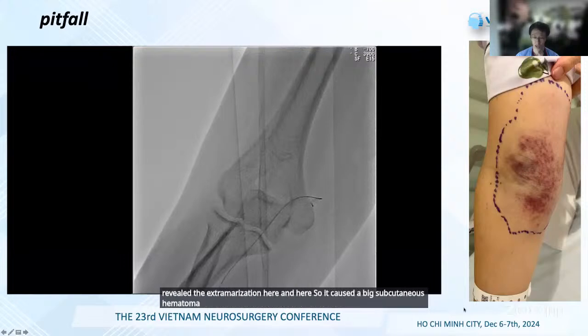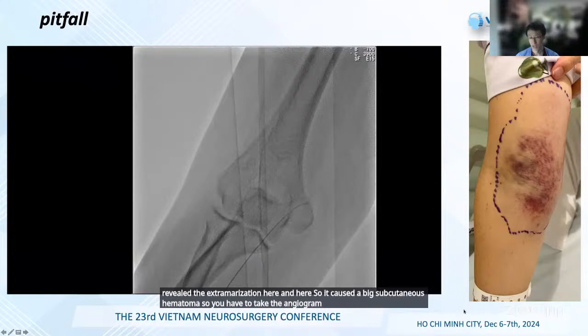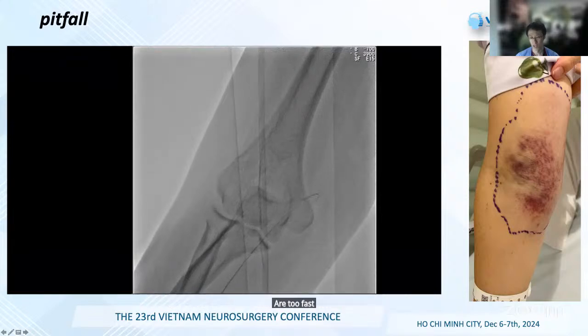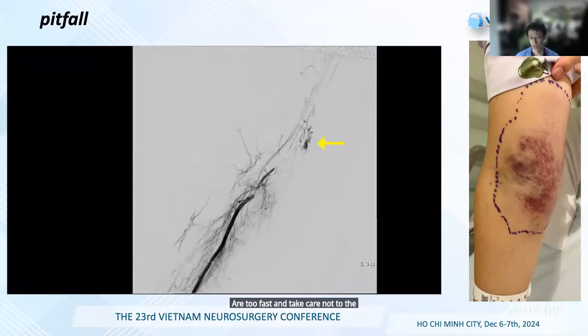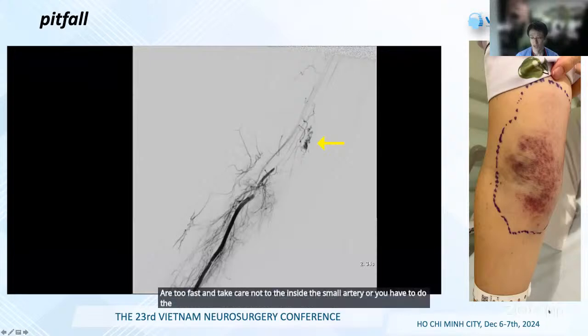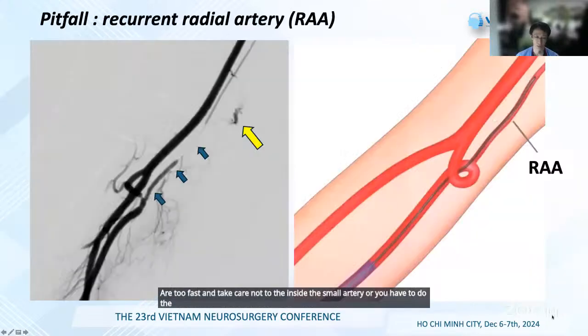So you have to check the angiogram first and take care not to insert into the small artery, or you have to do gentle manipulation.